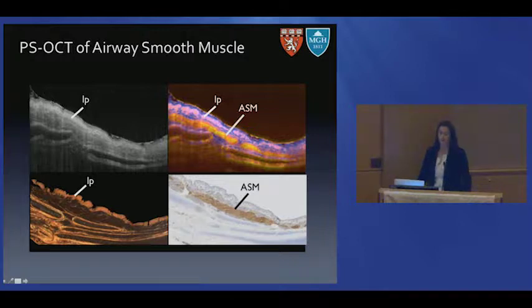And here is our normal structural OCT image that we would see. You've got your layered structure, the epithelium, lamina propria, other tissues here, which we do know include the trachealis muscle, given it's the trachea. And on the right, we've overlaid that with the optical retardation, the magnitude of that delay that we saw in the orthogonal polarization components of the light.